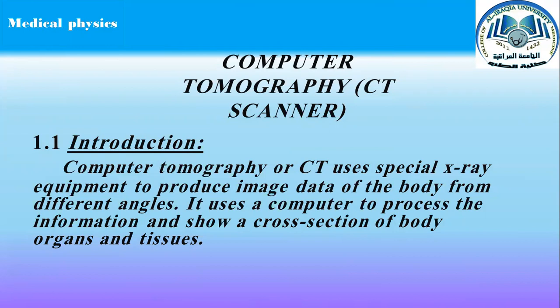It's famous now because the coronavirus use CT scan for diagnosis the damage for the lung because the coronavirus. For CT scan now to confirm this is coronavirus make damage to the lungs, and what is the percentage the damage happen.